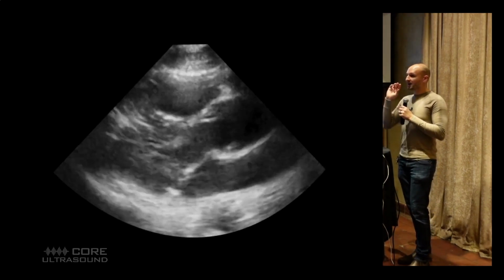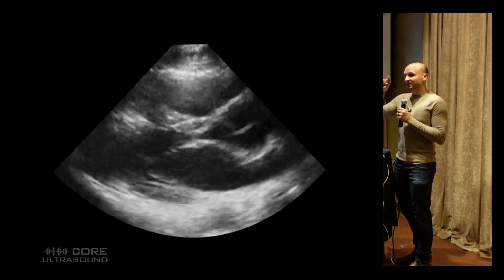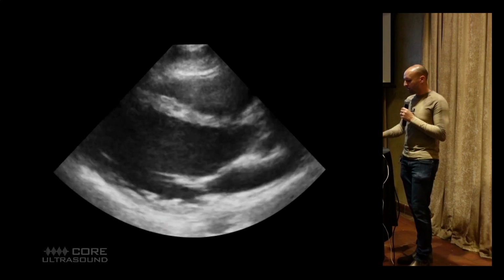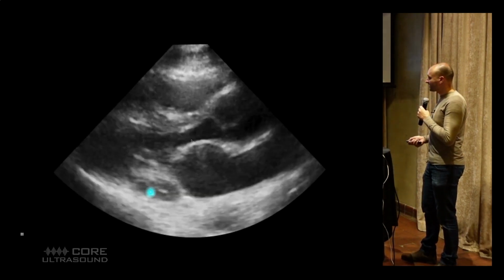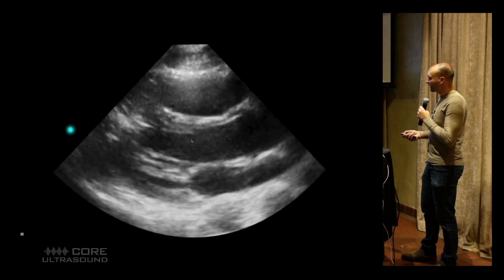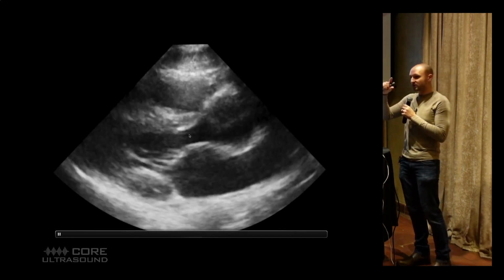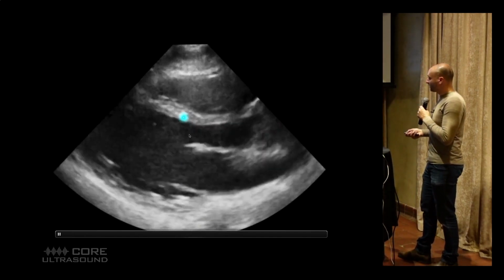We're looking for getting skinnier and bigger of a specific segment of the wall. You're looking for contraction of the wall of those ventricles, right? So if we look over here, you see how it's getting fatter and skinnier, all the way around. We lost the apex here. Up here, the septum, it's getting bigger and smaller. This is great contraction of the ventricular walls.